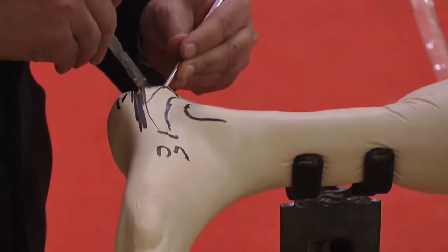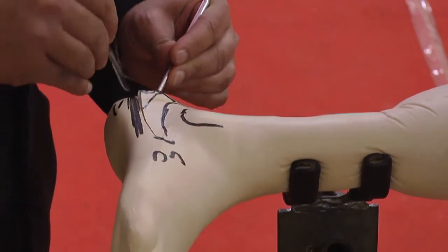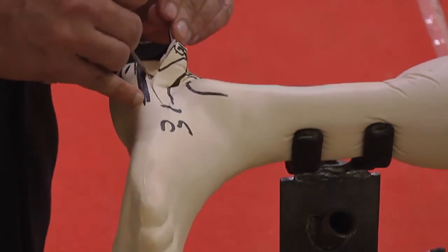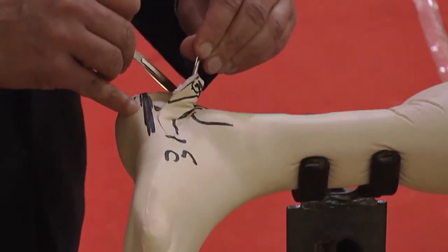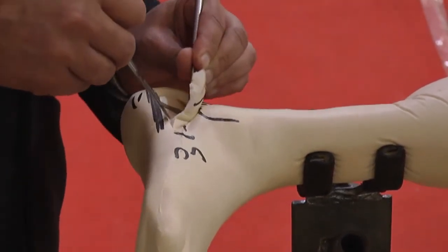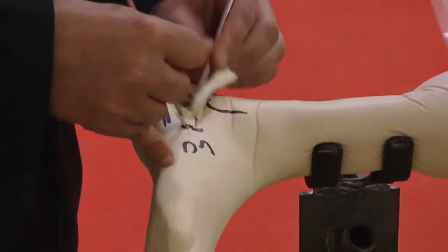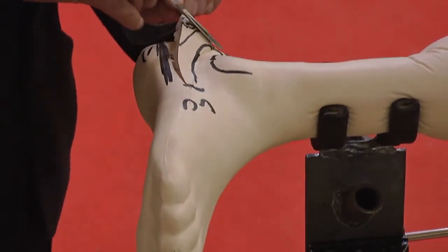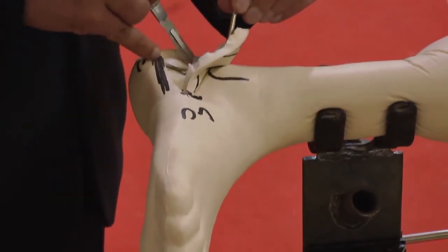You start your dissection at the level of the curve and then go deep onto the bone and just lift off this flap from the bone with your forceps. As you lift your forceps up, there is an area of junction you will see between the flap and the bone. So your knife goes and touches that area, and as far as possible subperiosteally, you lift off that flap from the bone. Now when you do that, the calcaneal artery will be in this flap, as well as the sural nerve, and you will not be cutting any of these structures.